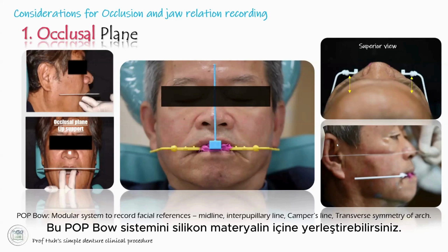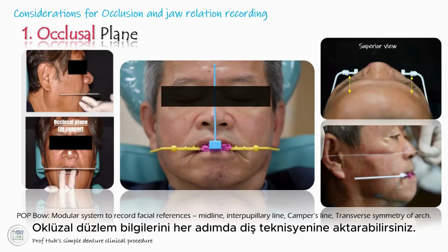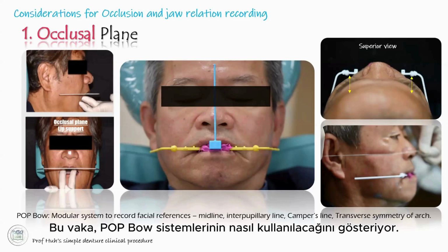So you can take the jaw relationship. Sorry, you can transfer the occlusal plane information to the dental technician in every step. Okay.